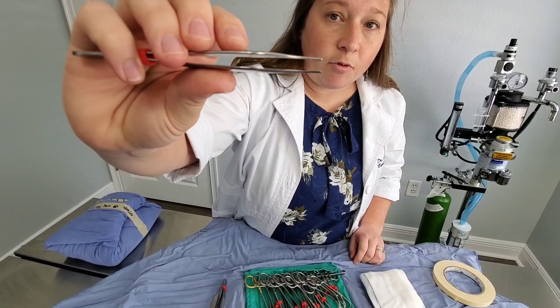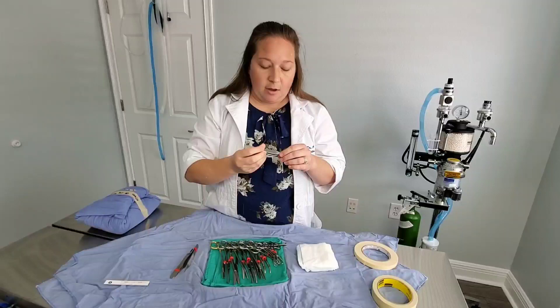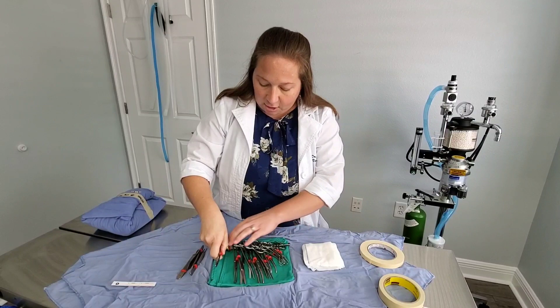This is my Brown Adson tissue forceps. These have some little tiny teeth on them and are kind of our go-to for other sorts of tissue handling — anytime I'm moving things around. They can be a little bit traumatic to the tissue so we have to be careful which tissues we use them on, but this is our general tissue forceps.